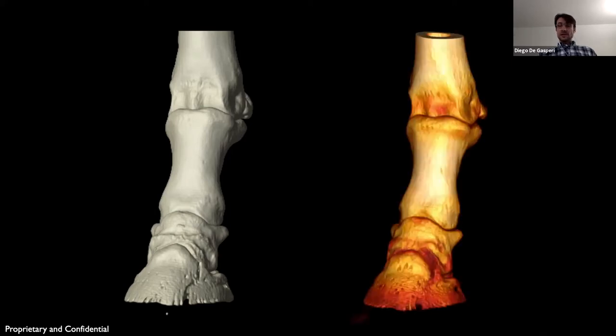He returned 10 weeks later for an appointment with our farriers, and we also re-CT'd the horse. This is the image from the recheck, which showed a quite good amount of bony healing at the fracture site. We discussed with the client the fact that it was difficult to determine how much each lesion was contributing to the lameness, but with the history of an acute lameness a week prior to presentation, at least the majority of the pain was most likely caused by the fracture.